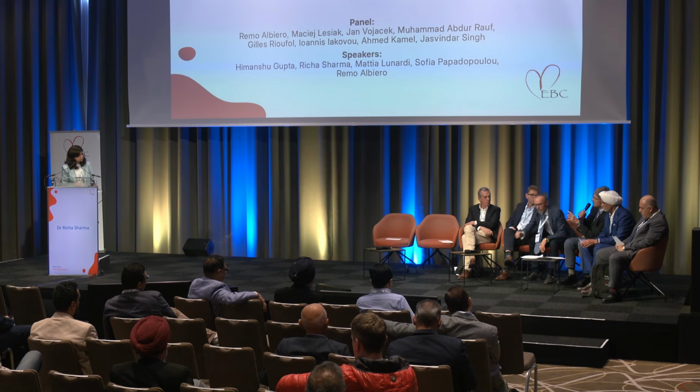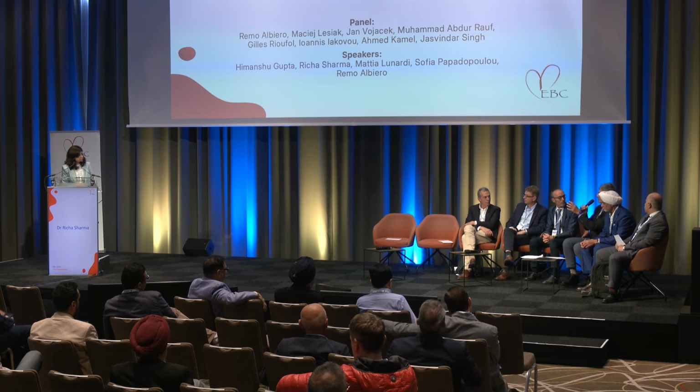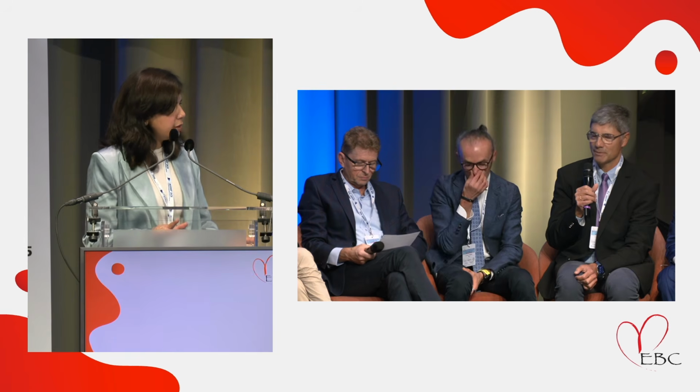This was an interesting tip, Remo. So I noticed that you have this combined approach using a drug-eluting balloon. Yes. But then after the drug-eluting balloon, you post-dilate with the same DCB. So we can do that. We can put another. So you're not afraid about the dilution of the drug? The drug doesn't go back. Yeah. It has already been delivered by the previous inflation. So you can just keep the balloon there and then put another NC balloon into the side branch or probably the main branch here, and then do a kissing balloon inflation with the same. So I don't see any disadvantage with that. Okay, good.